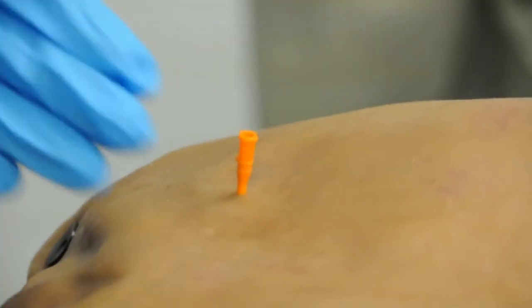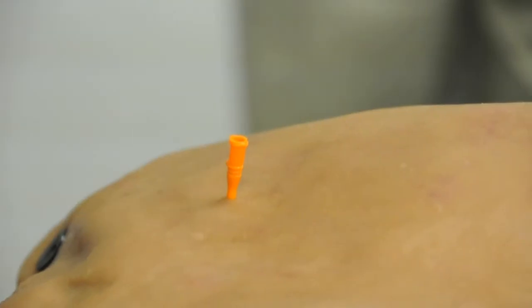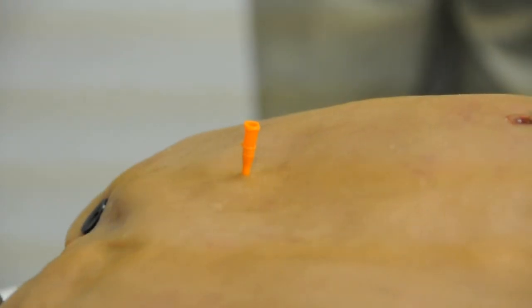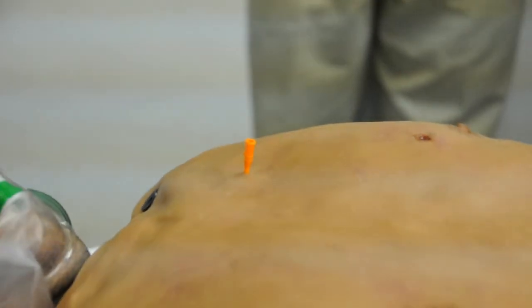Obviously, in the simulated patient, we did not demonstrate that the patient needs to be bathed and cleansed, but you're always going to do that in a rapid fashion as well.